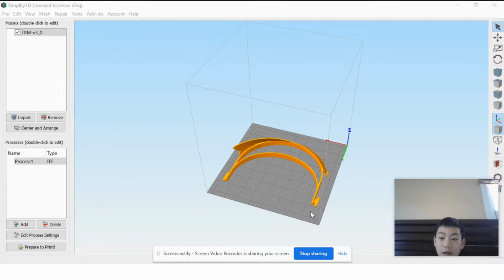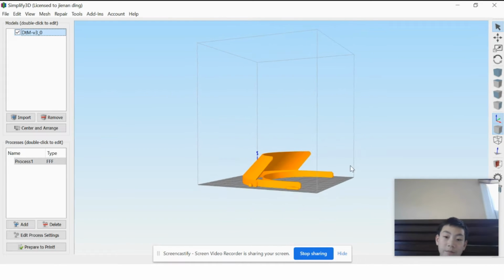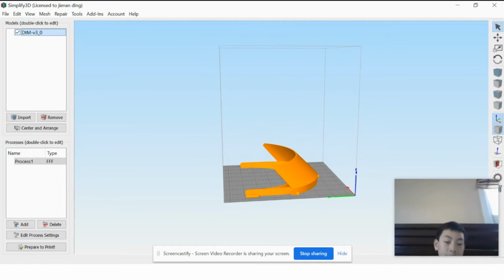Hey everyone, I'm Ian, and today I'll be showing you how to use the automated printing. First, you want to upload your print to your slicer, which I'm using Simplify 3D. You guys might not have this, but this is how I'm just going to show you. First, you want to make sure there's nothing wrong with your print and it's everything you want.